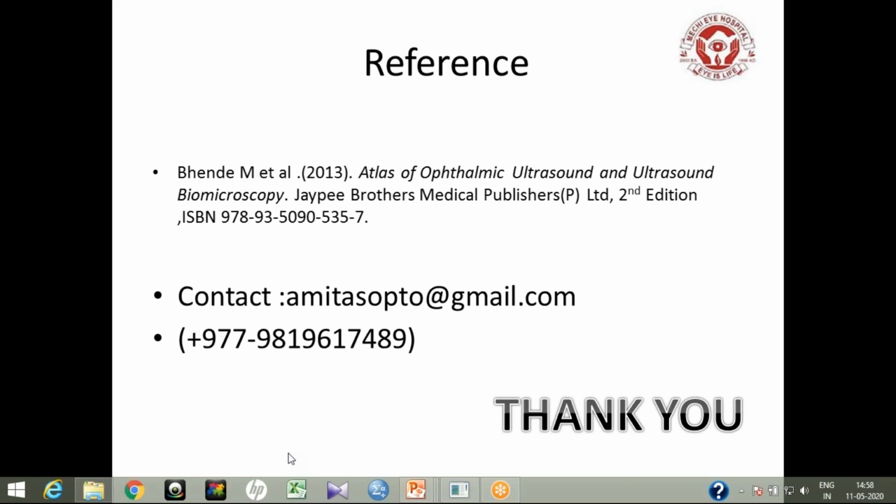Okay, so can you please say something about the ocular dynamic USG? Do you want to know about the kinetic scan?